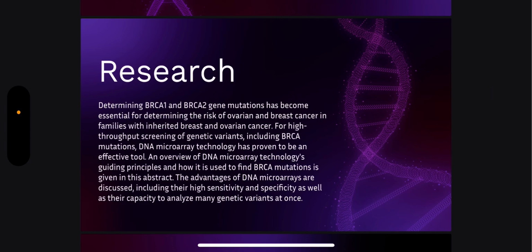So, my research consists of determining BRCA1 and BRCA2 gene mutations. This has become essential for determining the risk of ovarian and breast cancer in families with inherited breast and ovarian cancer. For high throughput screening of genetic variants, including BRCA mutations, DNA microarray technology has proven to be an effective tool.